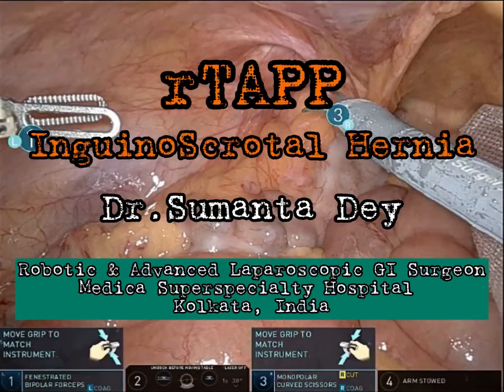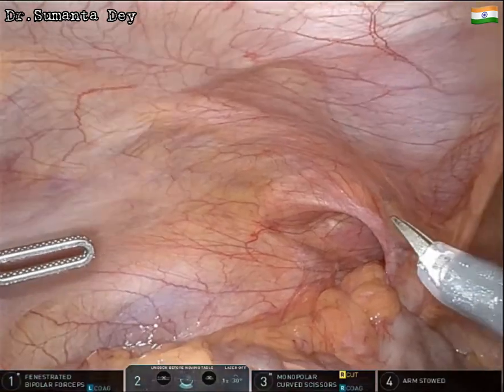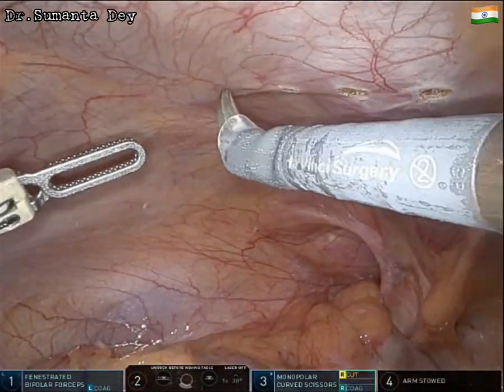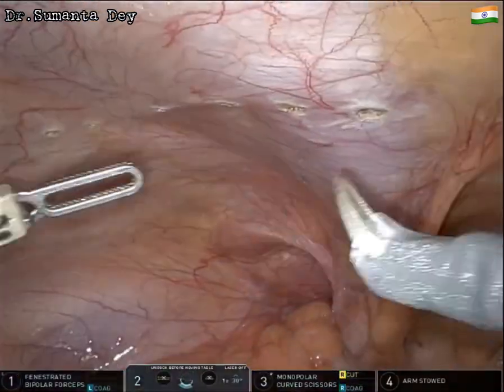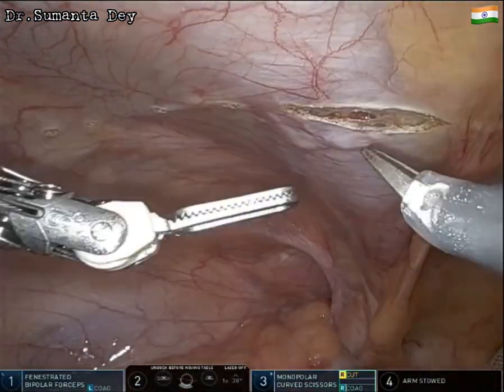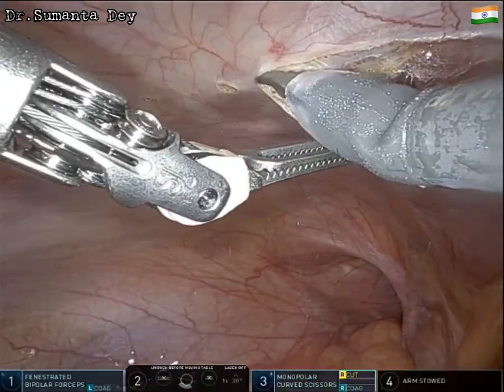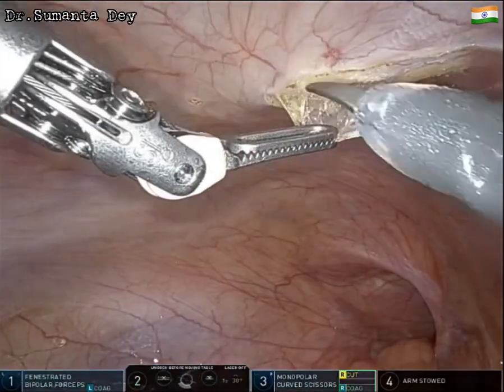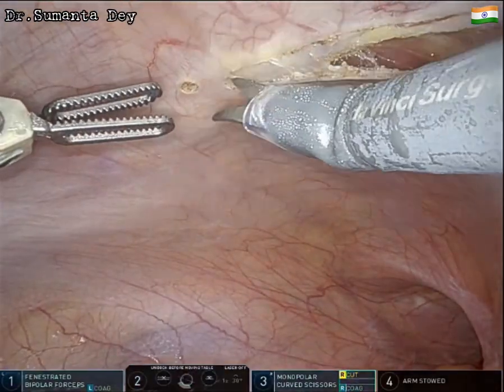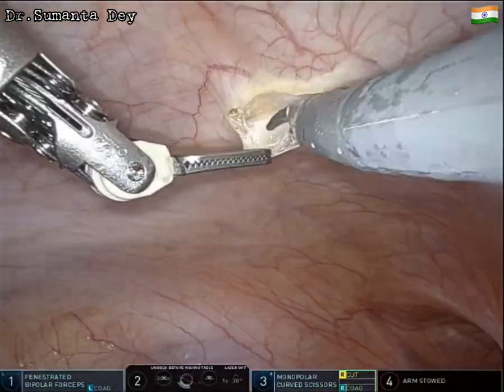This is a video of robotic TAPP repair for a case of indirect inguinoscrotal hernia. The patient is a 70-year-old man who had undergone right open inguinal hernioplasty five years back. He also had left inguinal swelling for the last four years, which had increased and came down to the bottom of the scrotum, making it an inguinoscrotal hernia.